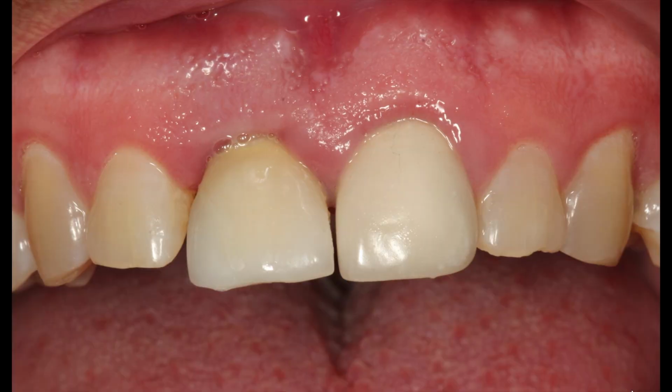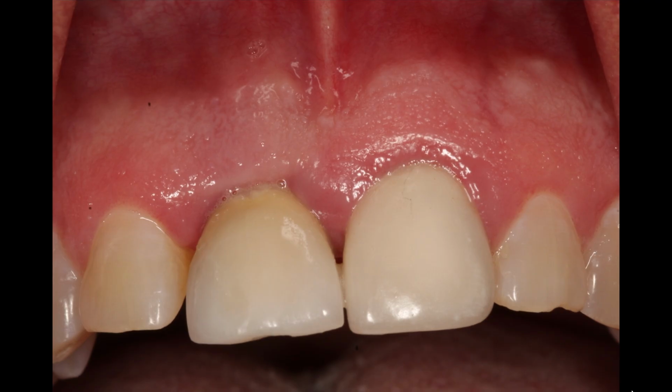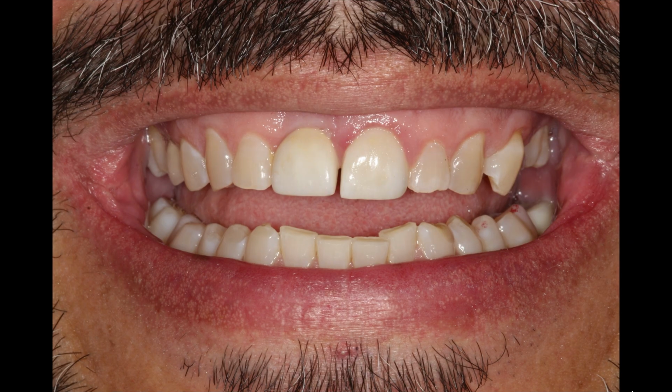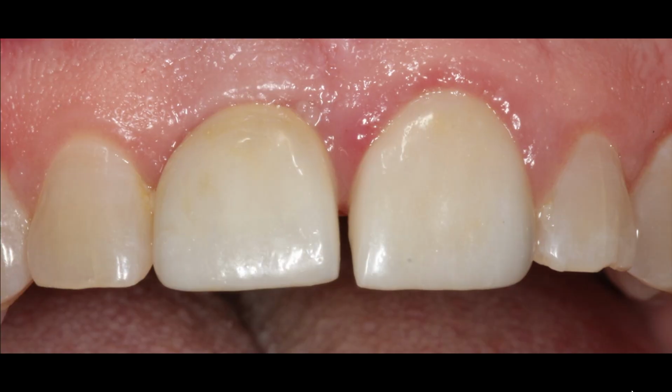So then we're going to get them back. This is now like 1 month post-op. Let's see what it looks like now. Very nice. The tissue's still there. The gingival architecture's there. All right, now we're here about 2 months later, and that's still looking really good. Look at that. Once it gets nice and stable, then you can take your final impression, get the final restoration, and this is the final restoration, so that's looking pretty good. And because we did all that fine work with training the gingiva, we still have the gingiva there. That's a very nice outcome. There's a nice little close-up for you. I think you can agree that's pretty good work.